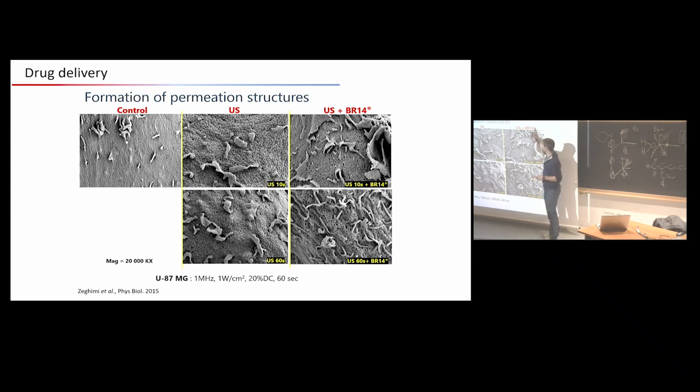Now, if we add some bubbles, this is a kind of bubbles from Bracco, I don't know if all of you are able to observe some holes like that everywhere. So that's what we call sonoporation. We can see some pores. And inside the pores, the drug is able to go in and do what we call transcytosis. So it's going inside the cell, and you can incorporate your drug inside the cell. So this is for 10 seconds, and at 60 seconds we have more holes.